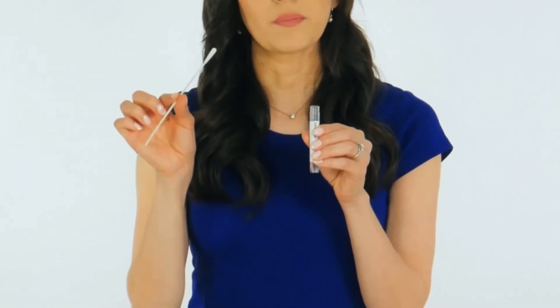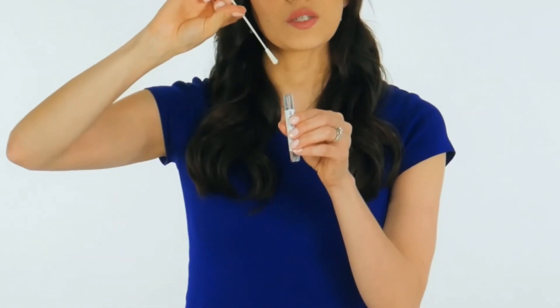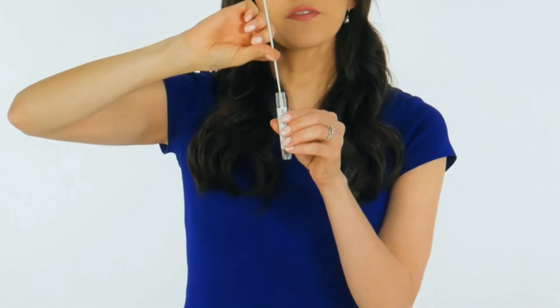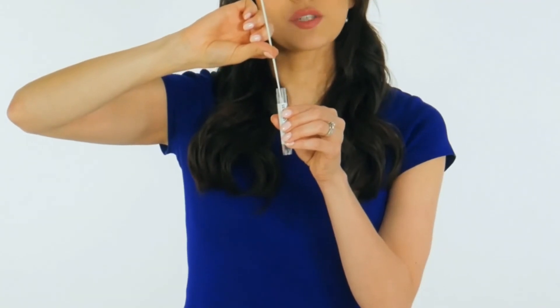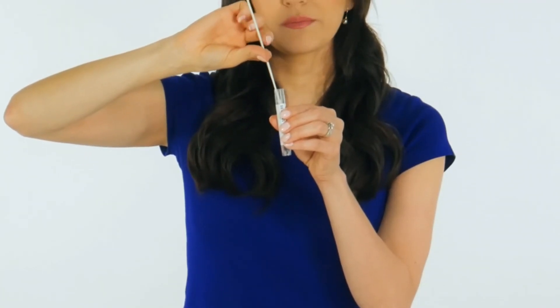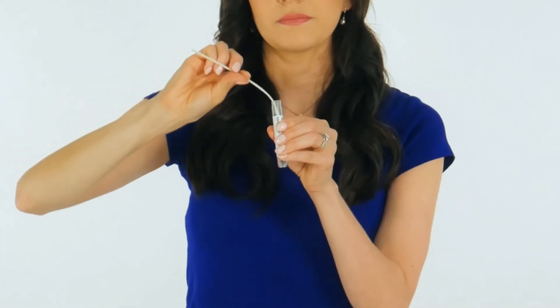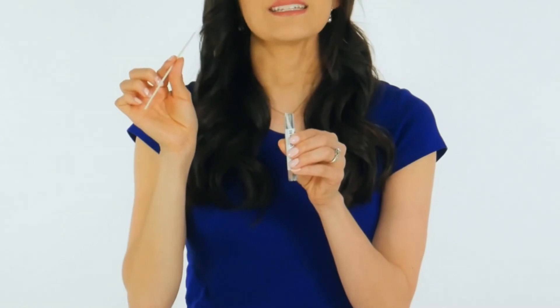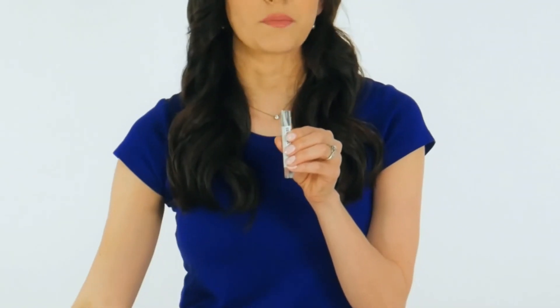Immediately place the swab into the transport tube so that the score line is at the top of the tube. Carefully break the swab shaft at the score line against the side of the tube. Immediately discard the top portion of the swab shaft.